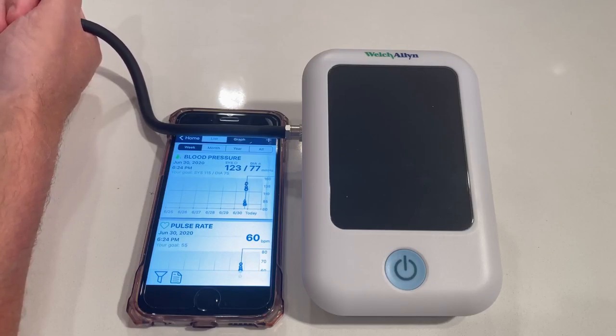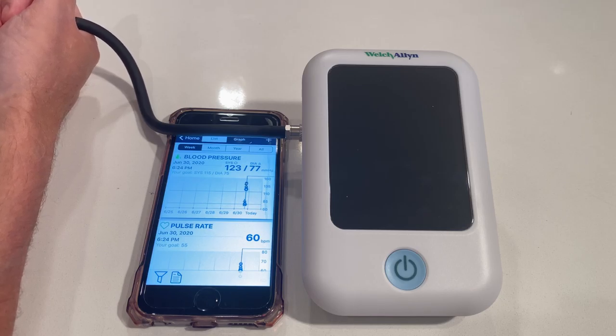Not so bad — I was expecting worse because it's in the middle of making a video and I recently ate a snack. This morning it was 108 over 67, which is typical for me in the morning. So it shows how much your pressure can fluctuate during the day, depending upon what you're doing.